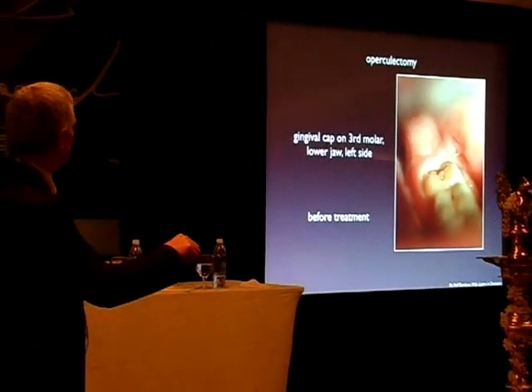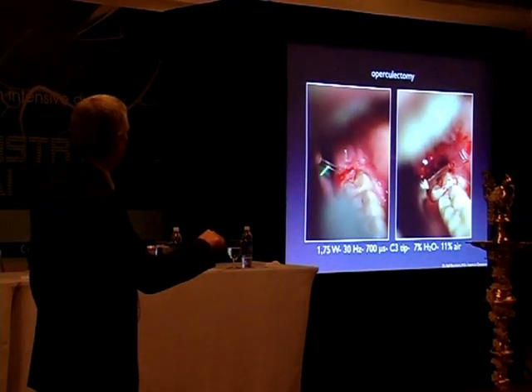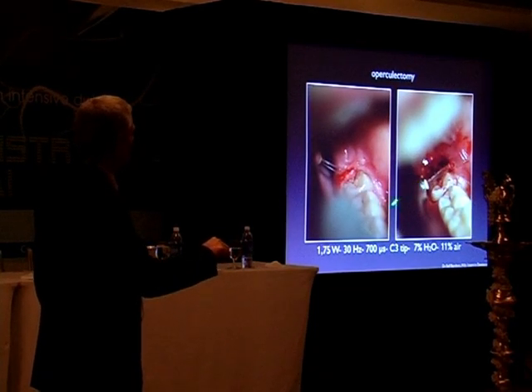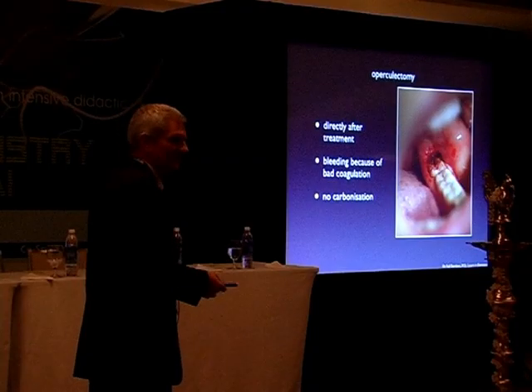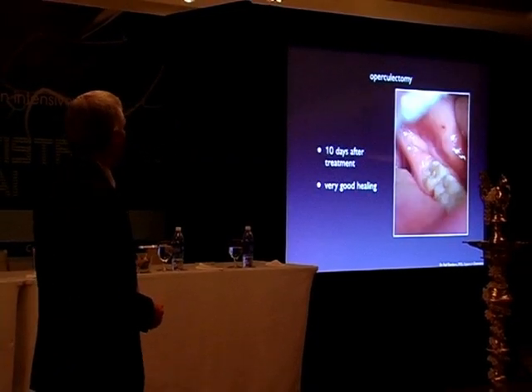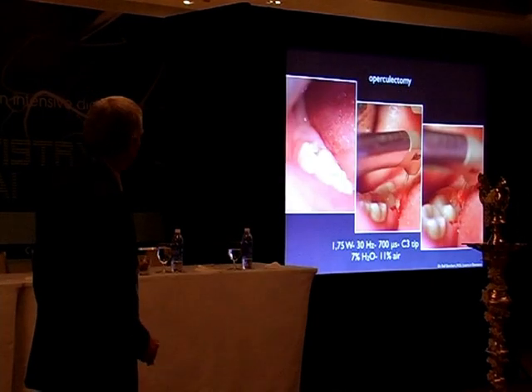This is operculectomy, gingival cap, third molar before treatment. You can see here the treatment with only 1.75 watt and a long pulse. And you can see there is a little bleeding if you use erbium chromium YSGG because it's not absorbed in melanin and hemoglobin. So you can expect a little bleeding. This is 10 days after treatment with a very good healing.